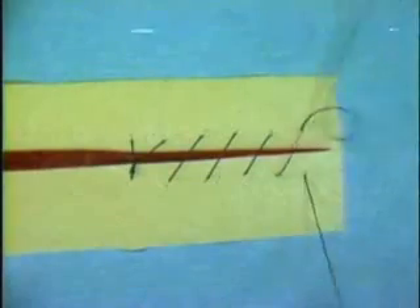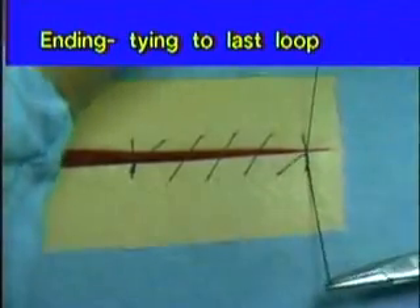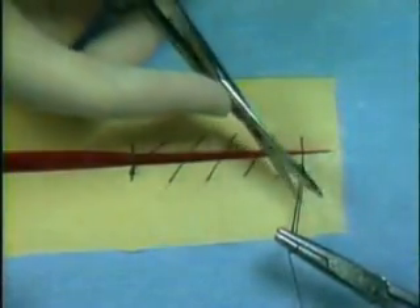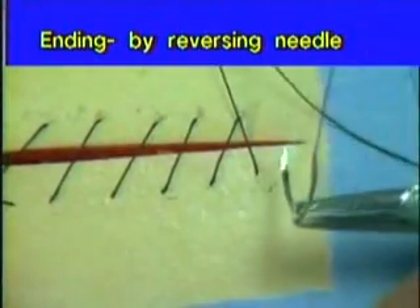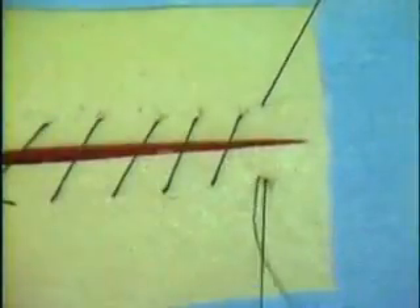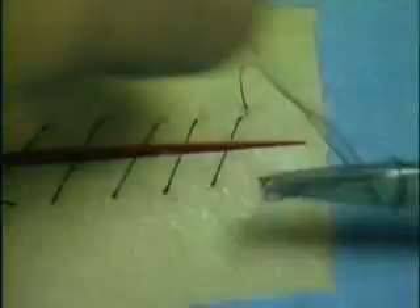Another problem is that of ending a continuous suture pattern. With a swaged-on needle, as you near the end of the wound, the suture strand directly trailing the needle can be tied to the last loop in the continuous suture line. A more cosmetic technique is to end the swaged-on needle suture line as follows: once the last stitch closes the wound, the needle is reversed and inserted close to the needle exit site, directly opposite the last needle passage, and the knot is tied from the needle strand to the remaining narrow loop. This technique reduces tissue bunching, seen especially when a continuous line with large gaps between tissue bites is tied at the end.